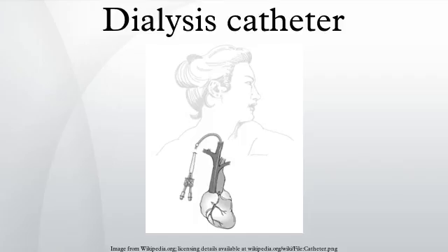Catheter placement: the catheter is placed in one of the large veins. A common site is the superior vena cava, or SVC. An SVC catheter is placed by puncturing the internal jugular vein in the neck, and the catheter is then advanced downwards toward the chest. Alternatively, an SVC catheter can be inserted via the subclavian veins. The femoral route is an inferior option, however, because the groin site is more prone to infection and also because the patient cannot sit upright.